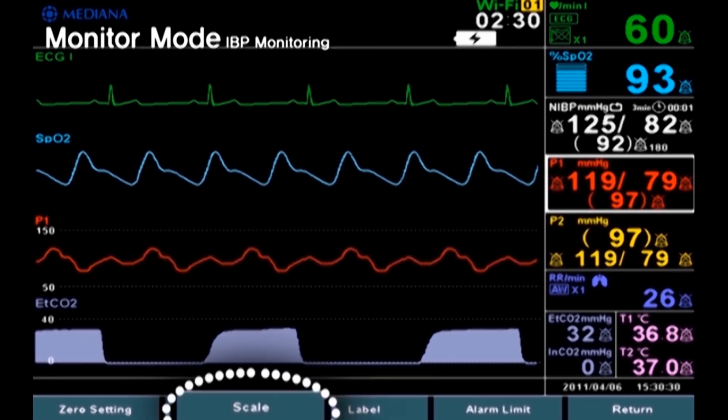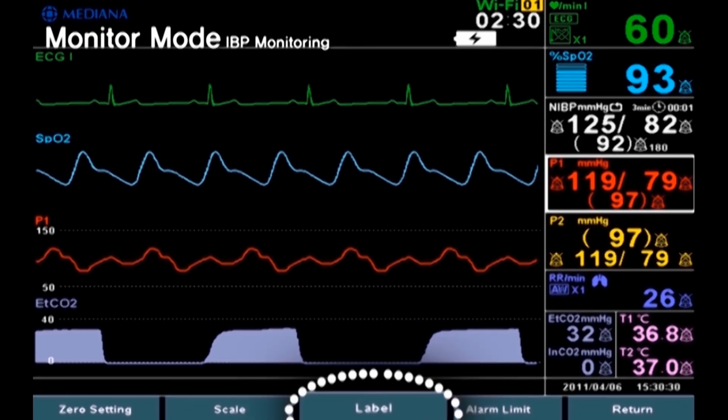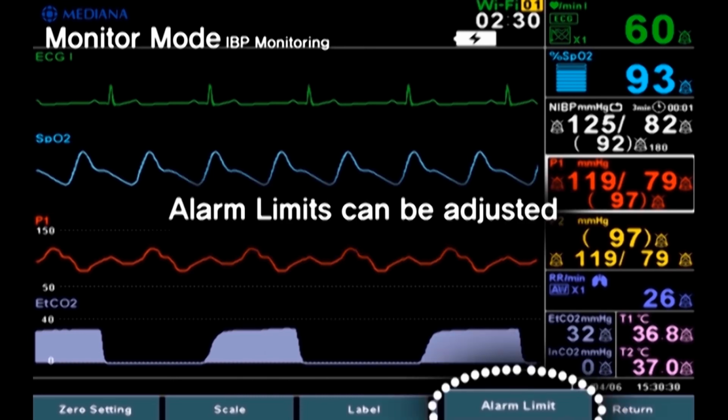Number 2. Scale. 0 to 50, 100, 200, 300, and auto. The user can select the scale of the IBP waveform. When auto is selected, the monitor will automatically set the scale upon the measurement value. Number 3. Label set. P1, ABP, P2, CVP, PAP, LAP can be set. Number 4. Alarm limit. Alarm limits can be adjusted.